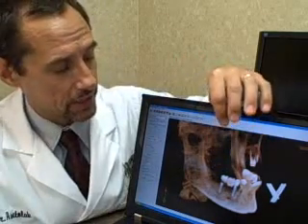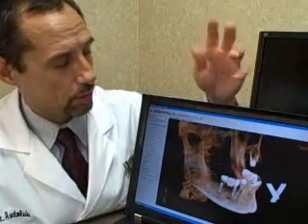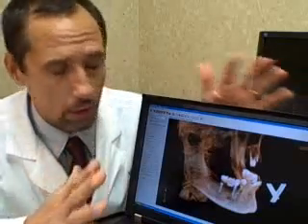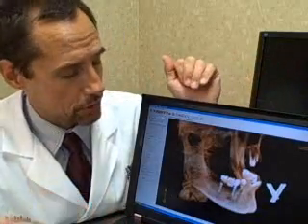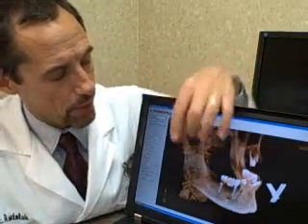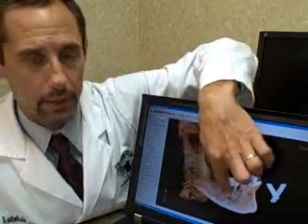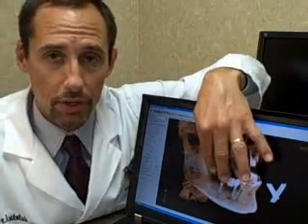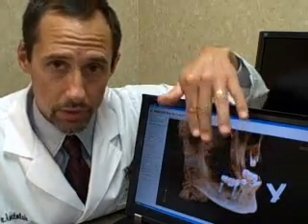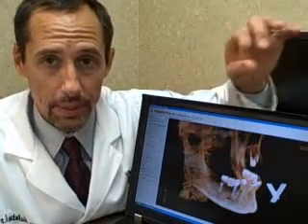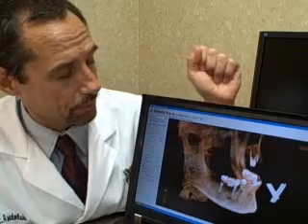I can actually place an implant in here wherever I would like and move it all around to determine the best position. What I have marked here in red is where the nerve would be. We place the implants to avoid the nerve and where there is the most bone possible, so we can get the best result.